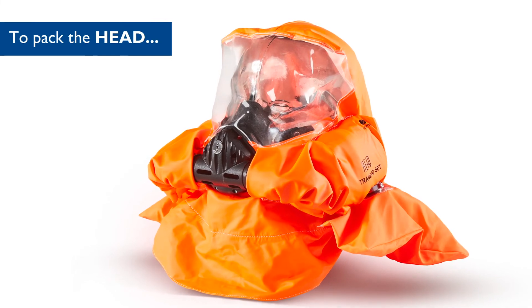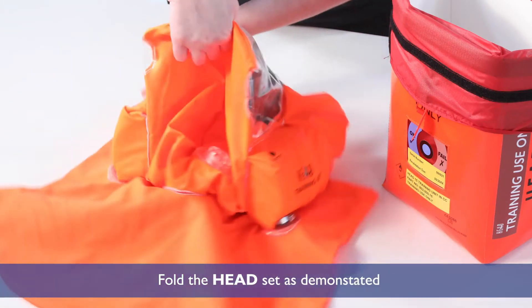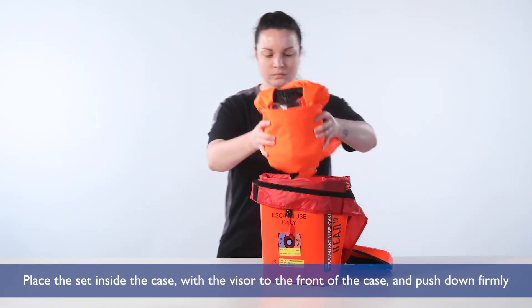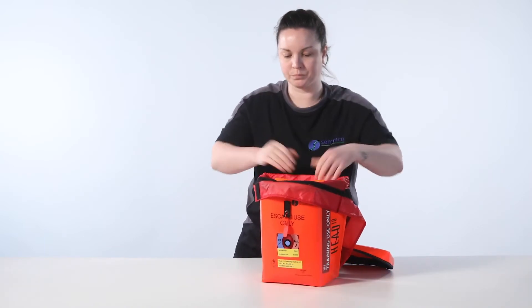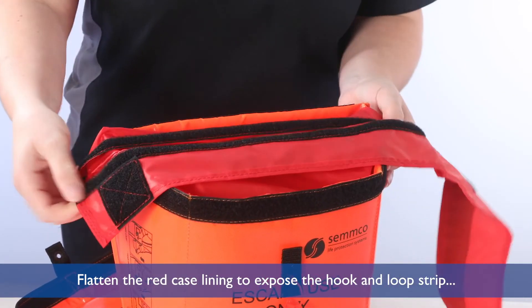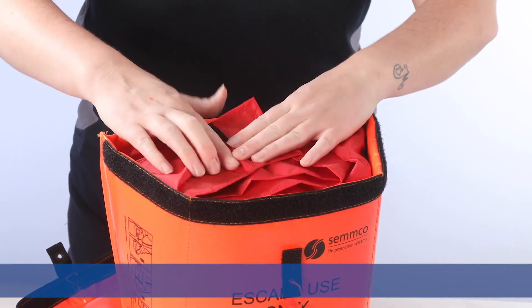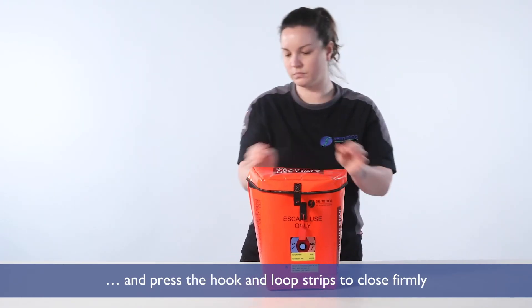To pack the head, fold the head set as demonstrated. Place the set inside the case with the visor to the front of the case and push down firmly. Flatten the red case lining to expose the hook and loop strip and fold over the flap to seal the bag. Fold inside, replace the lid and press the hook and loop strips to close firmly.